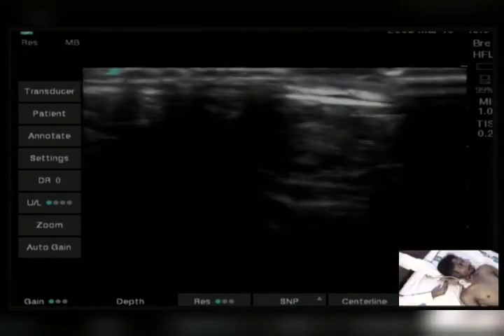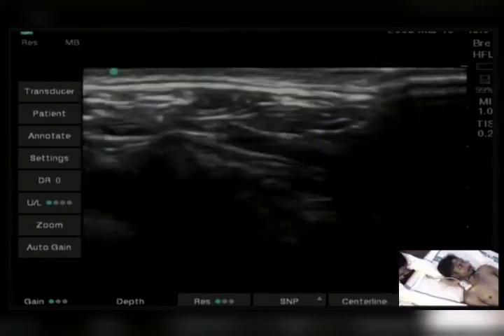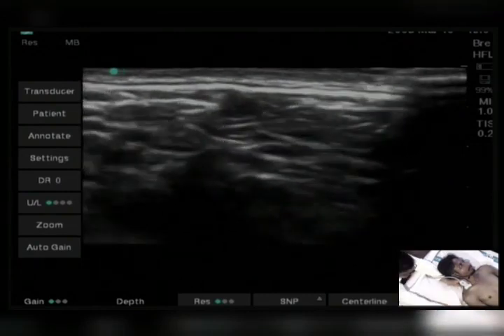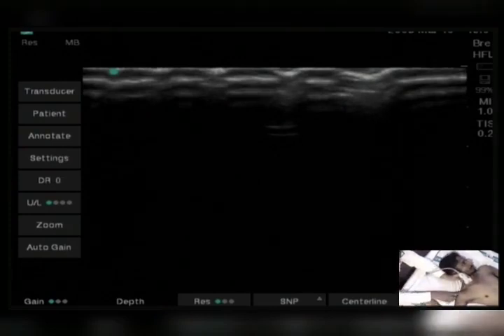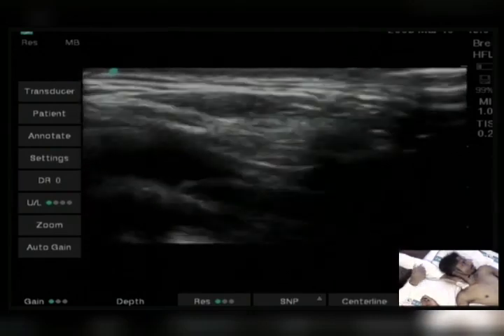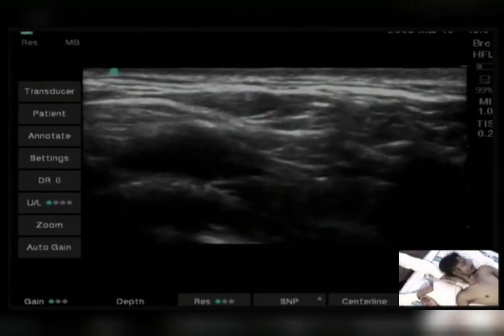So above the clavicle, the patient is supine and the arm is just like this. Okay, the arm is straight. Below the clavicle, the arm is abducted and the elbow is flexed, both at 90 degrees. Okay, not too much. And I will try to show the costoclavicular. See, this is from the supraclavicular fossa and going into the costoclavicular space.